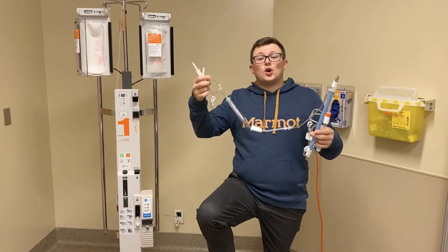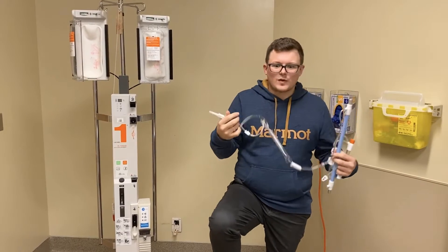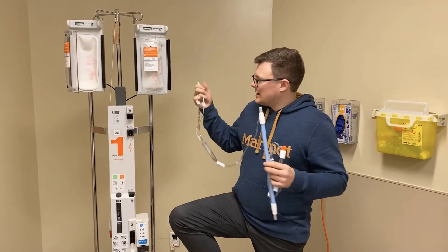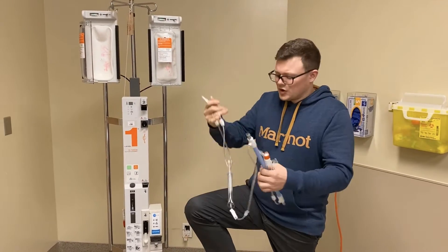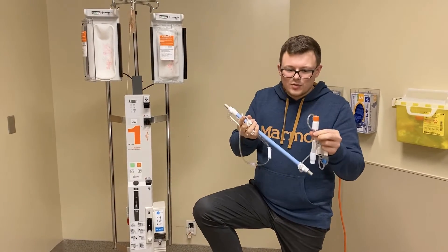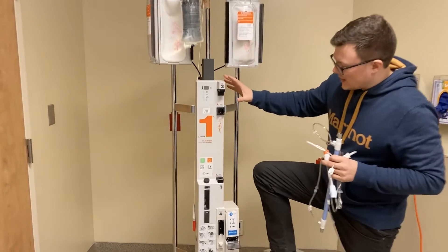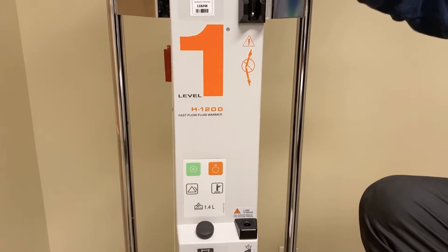Now we're ready to actually hook up our tubing and prime. A lot of people find this the most nerve-wracking part, but there are a lot of fail-safes built into the system. Once you've done it a couple times you'll get used to it, and even if you don't get all the air out of your line, there is a filter designed to remove air from the system — so as long as you get most of it, you're doing fine. On the Level 1 there are four numbers, and those are the numbers you follow while priming.